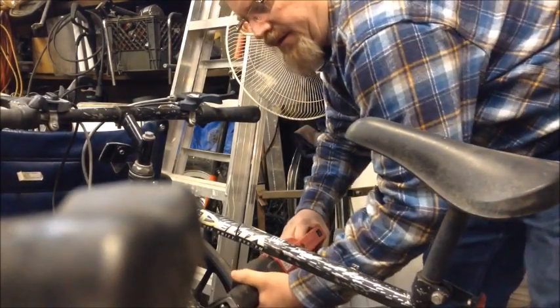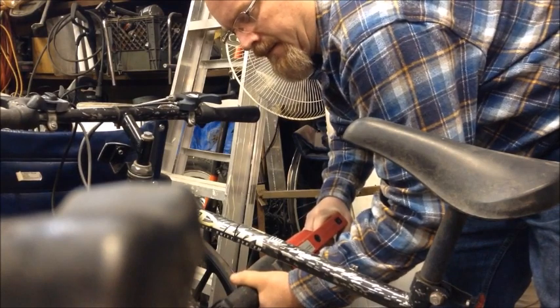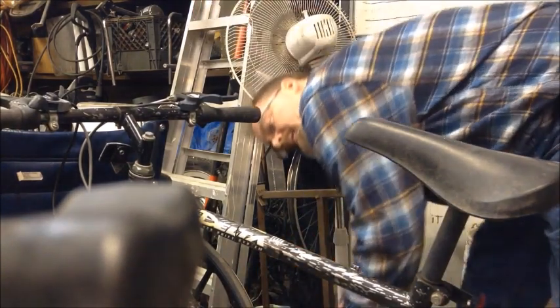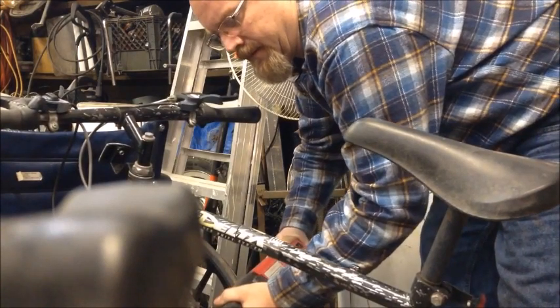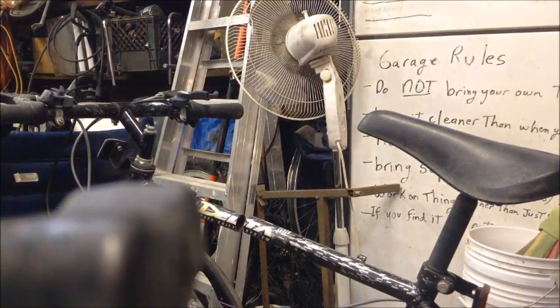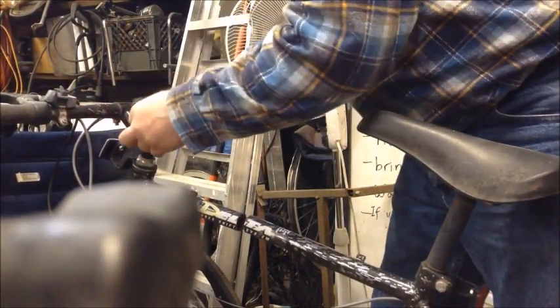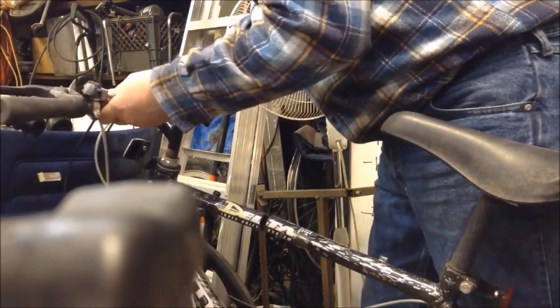Now we're going to notch it down here to allow it to spread open. Yeah, we didn't cut all the way through. I need to go a little bit further. Good. So that's going to allow this to come open. Oh, I'm going to have to raise this up to give me some room. All right. I'll loosen that. Yeah, that's better.